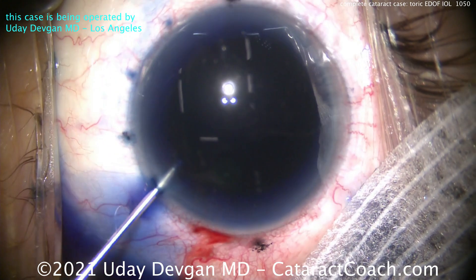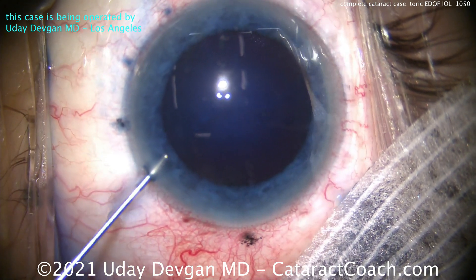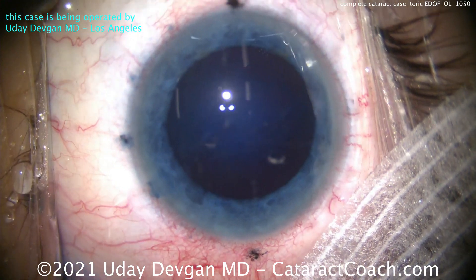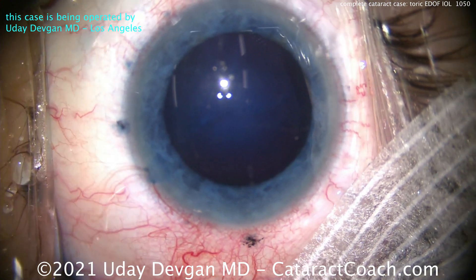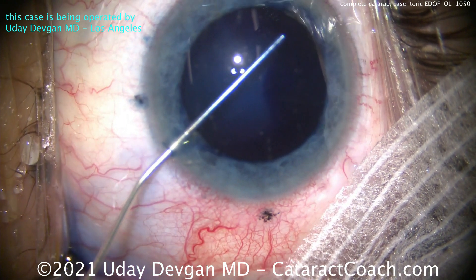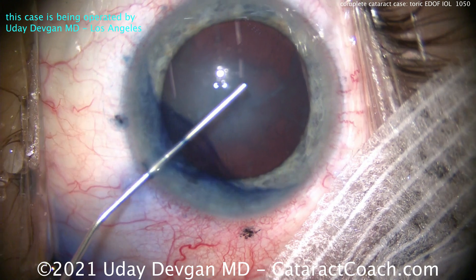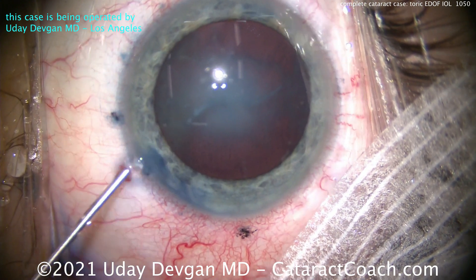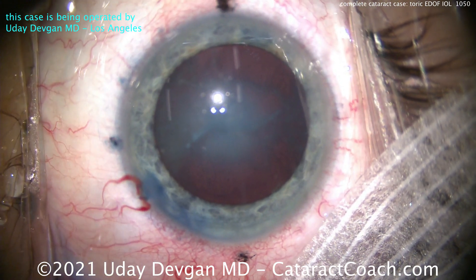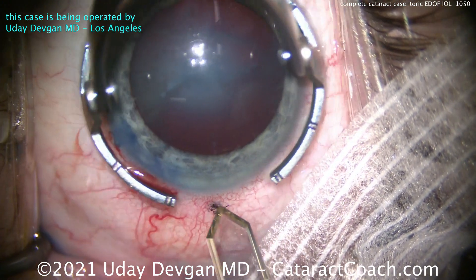Now we're waiting for the trypan blue dye to take its effect and stain that capsule. Remember, it also decreases capsule elasticity — in a young person like this that capsule can be almost too elastic. We dilute the dye with some anesthetic, and here's our dispersive viscoelastic going in and exchanging out the remainder of that dye. There's the cataract — you can see it's very opaque in the middle. The patient had quite poor visual acuity, about 20/200, and this is the patient's better eye.